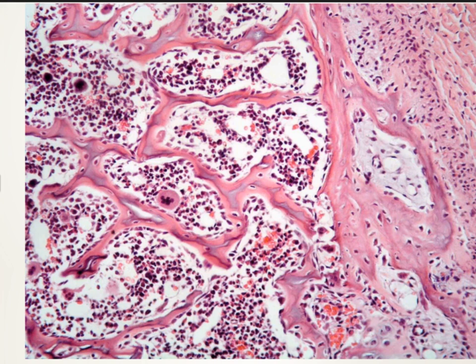Here we have also the osteocytes inside the bony trabeculae, and these bony trabeculae are facing the bone marrow. You can see here in the lining of the bone marrow the osteoblasts. So all of these are bone marrow cavities, and these are the spicules of the bone. Of course, all of these are the blood cells.